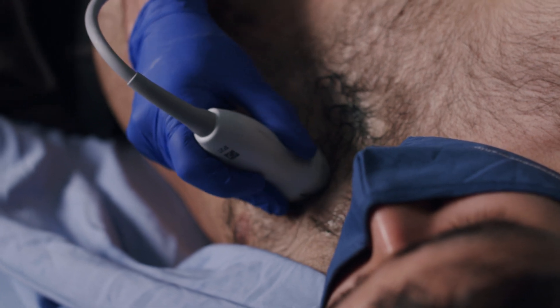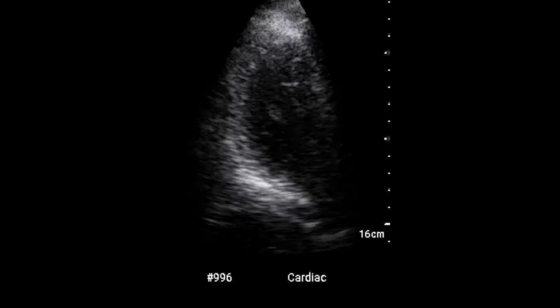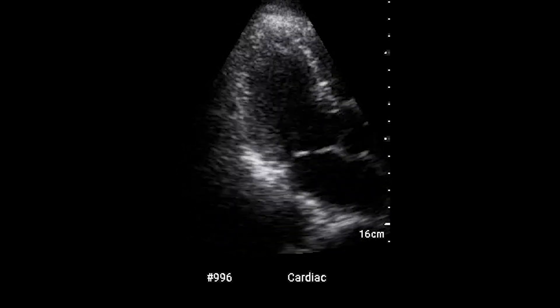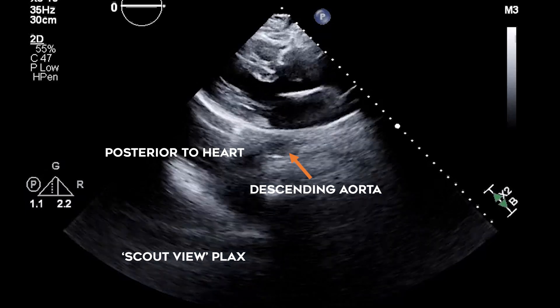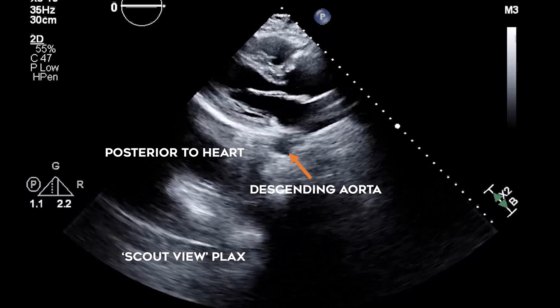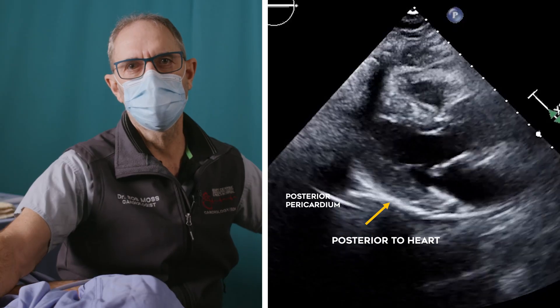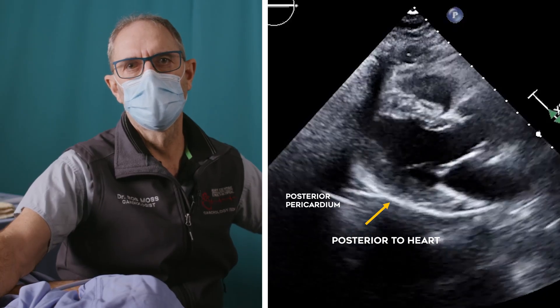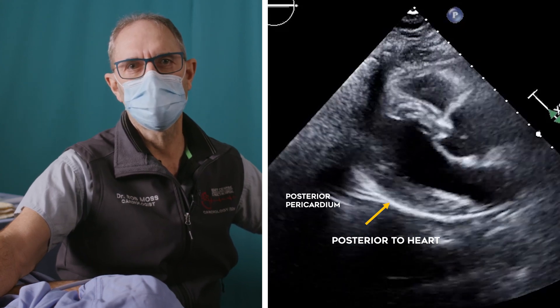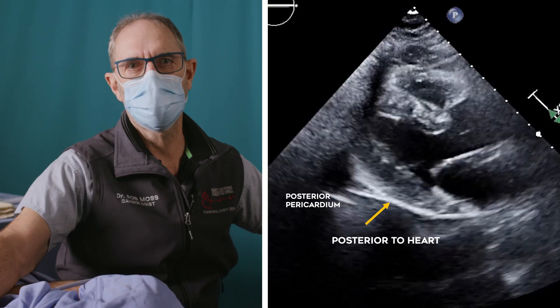The septum should be relatively horizontal. If you slide too far caudal, you will see that the heart appears smaller and the septum becomes more vertical. It's usually a good idea to start with a maximal depth setting. This helps to visualize structures posterior to the heart, such as a left pleural effusion. Once this so-called scout view is obtained, the depth is reduced so that the heart and the descending thoracic aorta are seen on view.